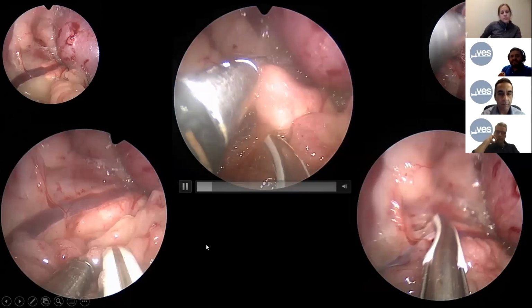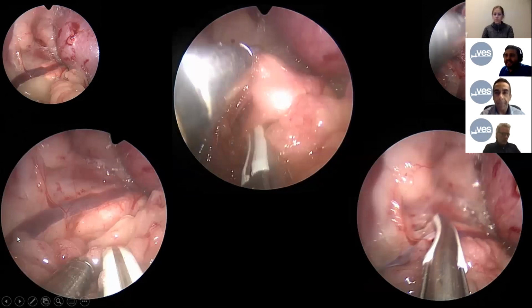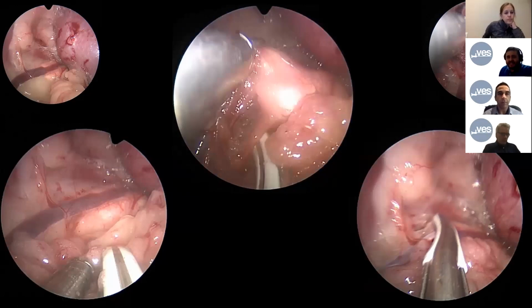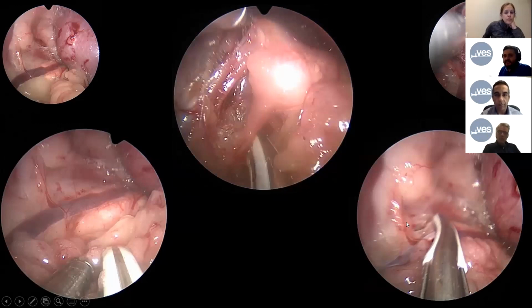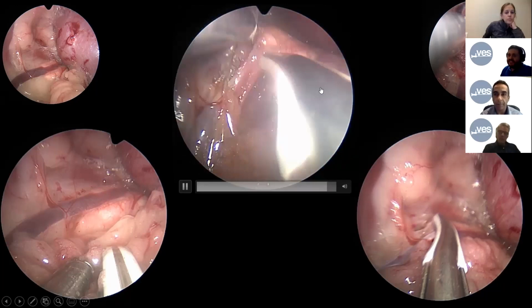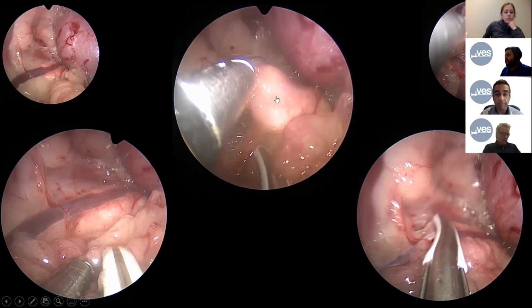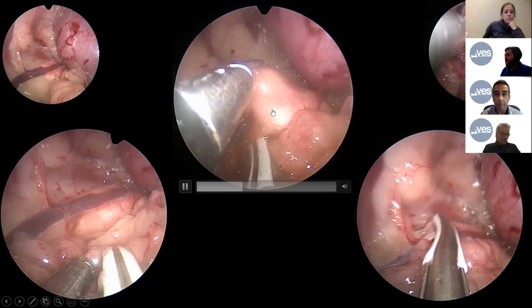Here there are some images of the surgical field. On the left side, you can see one tumor with a phrenicoabdominal vein passing by. We usually start with the vascular control, sealing that vein, as this other image shows. In the video, you can see how we dissect the gland from caudal to cranial, grasping the gland from the severed vein or the caudal adrenal pedicle, also severed or sealed. That's the idea of the technique. It is a very small working space, but it's not that difficult.